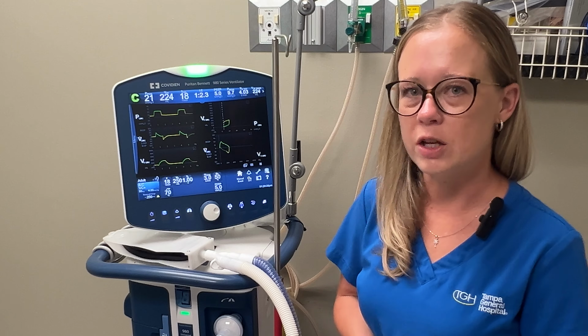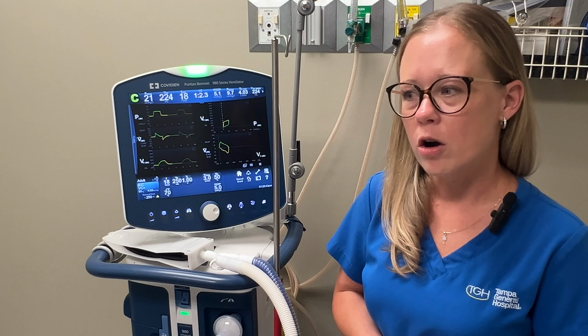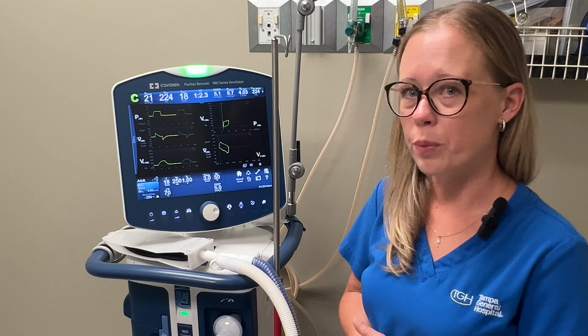We see this a lot in COPD patients. If they are auto PEEPing, that means they're air trapping, then they probably need more time to exhale, to empty their lungs. That's a time that you're going to need to call your RT to make that adjustment.